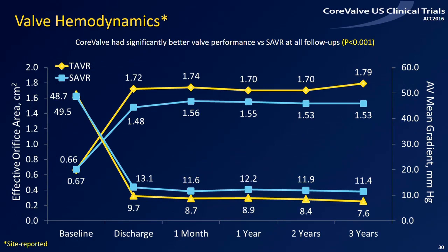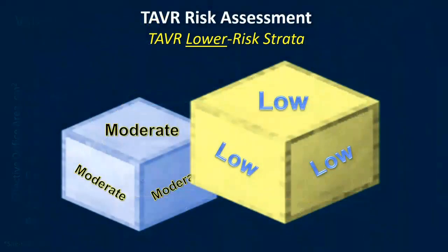Also, there is an edge of superiority with respect to the hemodynamics because we're using larger valves, based on CT. We try to educate our surgeons, why don't you do CT for every patient that you are doing SAVR, because you may find that you need to put in much larger valves. They are kind of pushing back on that, but I think given our results, they have to pay attention also to the imaging. Now we're going to the moderate and the low risk.